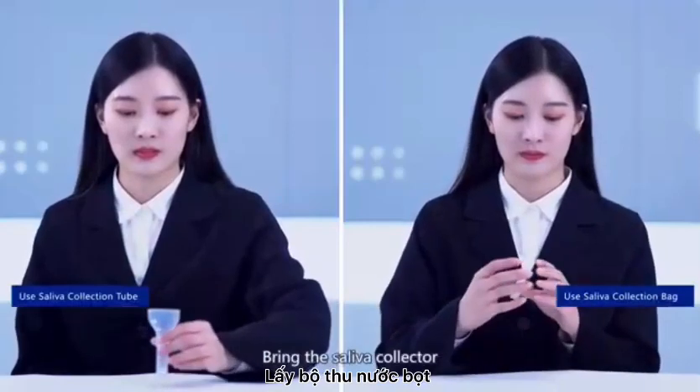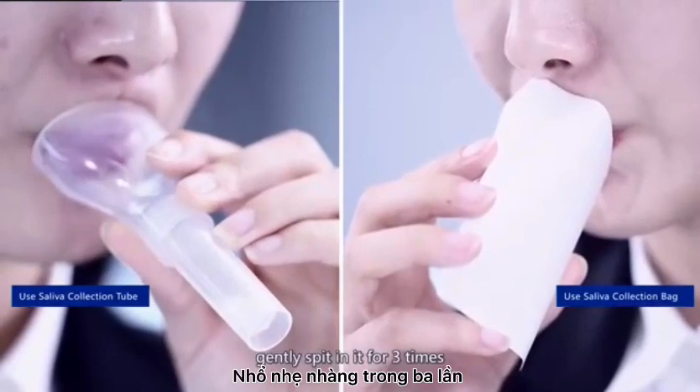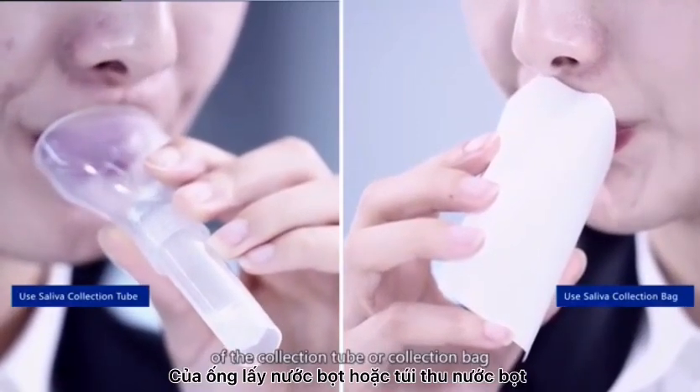Bring the saliva collector or saliva collection bag close to the lips. Gently spit into it 3 times. Let the saliva flow into the bottom of the collection tube or collection bag.